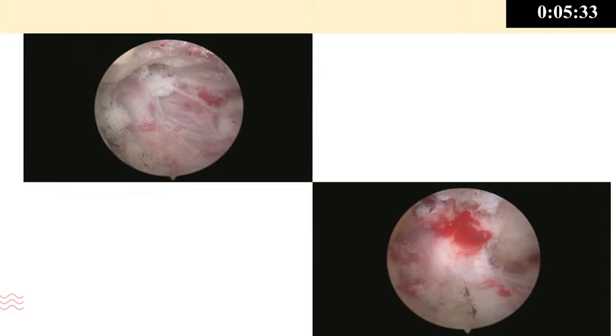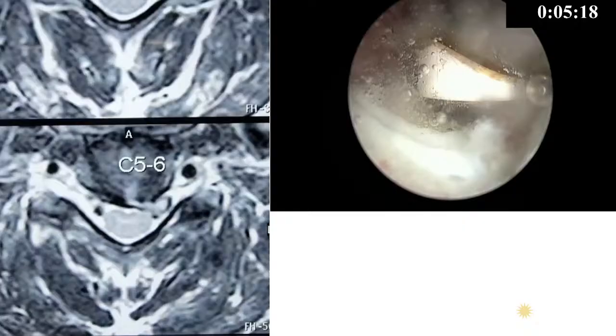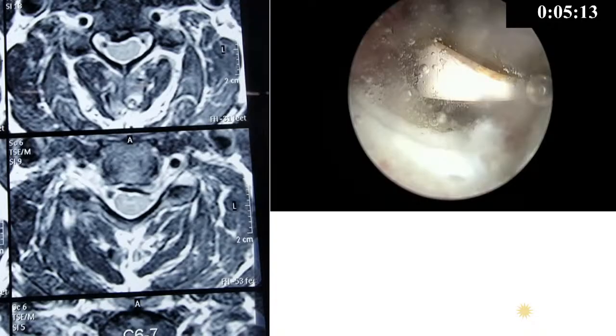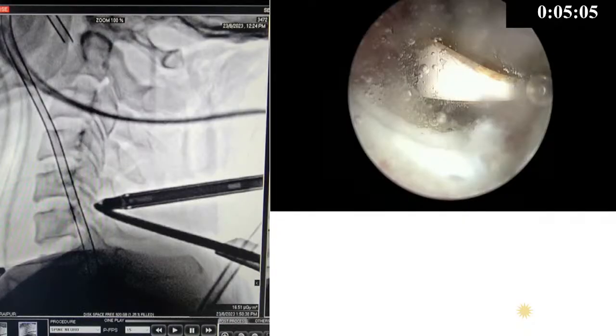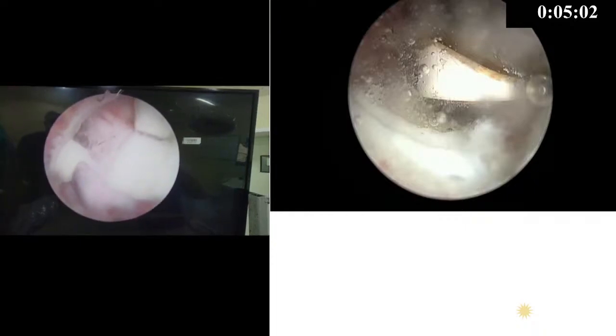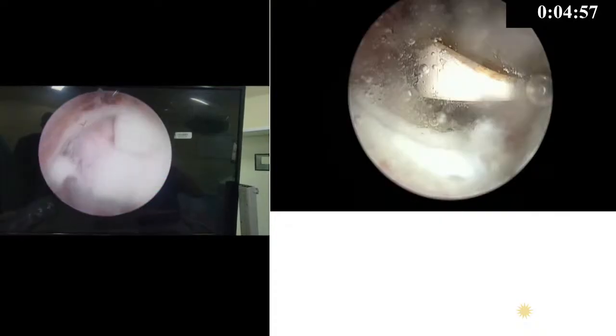Now this is the patient. There is a large herniation over here. This was an extrusion at C5, C6, and this was a photograph taken just after the removal. And this patient had a pre-existing weakness of shoulder abduction, which gradually improved 3 months after the surgery. Immediately post the surgery, even I was scared. The patient was like, "Sir, I have no improvement." I was like, "Wait, give it some time." With physiotherapy, he improved.